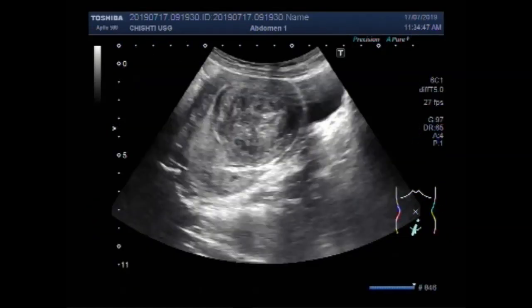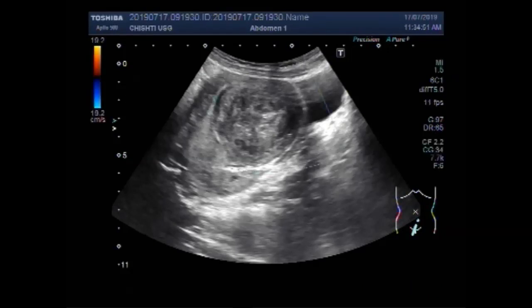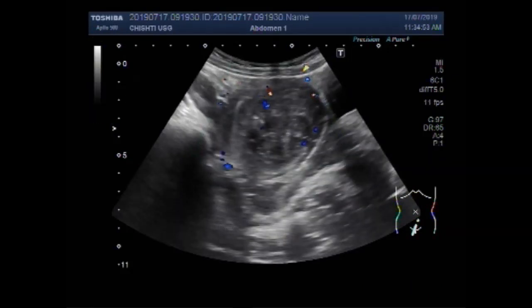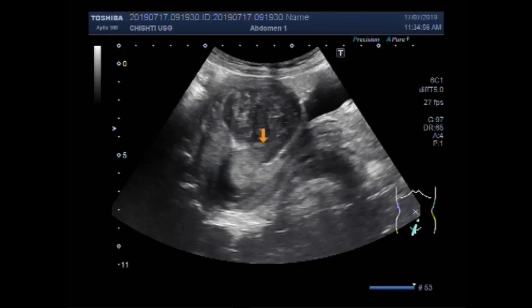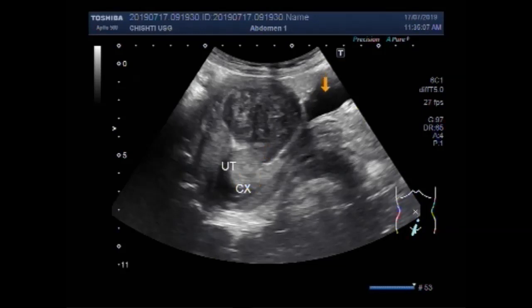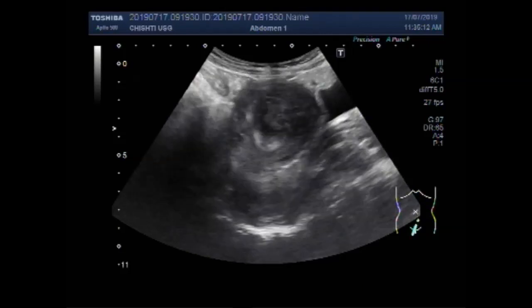Now you are going to see another video showing a large uterine mass. This is the uterus. This is the cervix, this is the urinary bladder, and this is the large uterine mass.